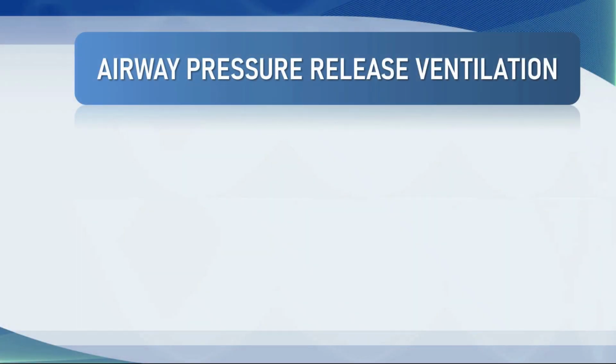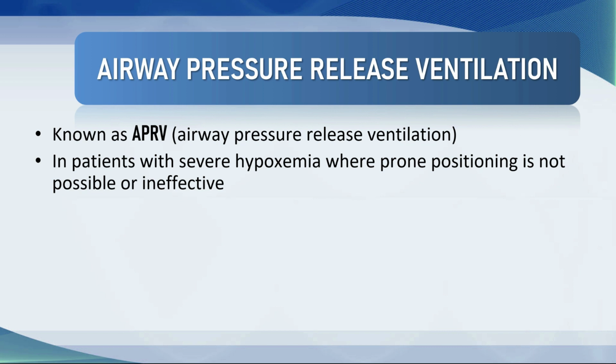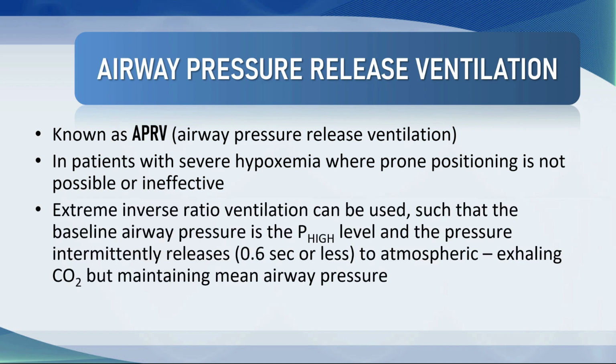Airway pressure release ventilation is not a mode of ventilation per se. It is a ventilatory strategy, and it's often known by the abbreviation APRV. It is used exclusively in patients with severe hypoxemia where prone positioning is either not possible or it's ineffective.